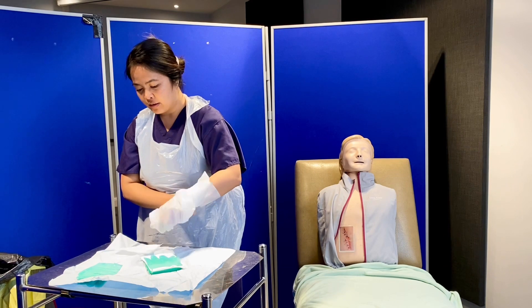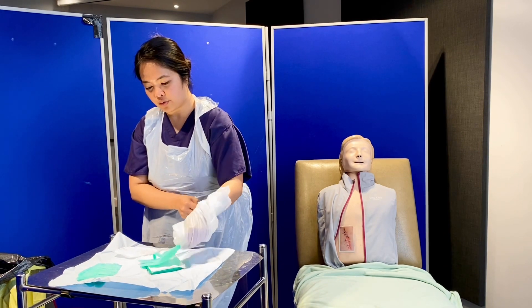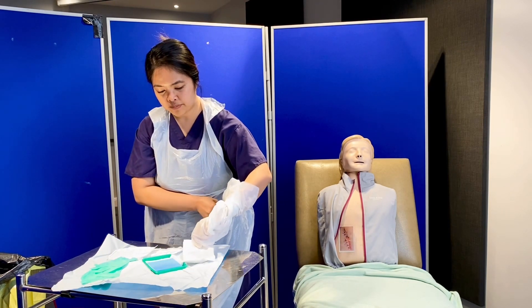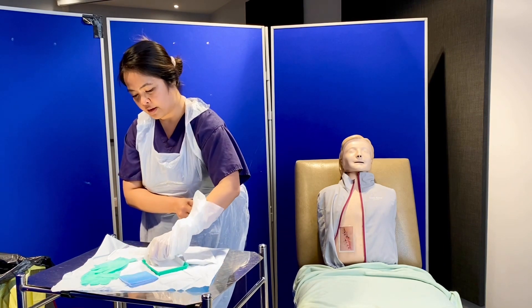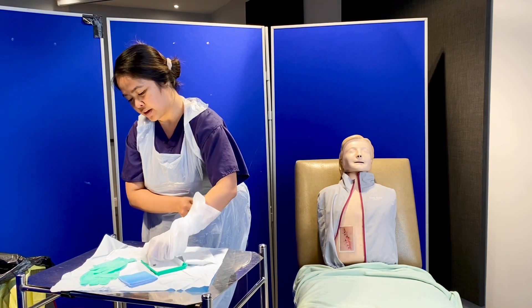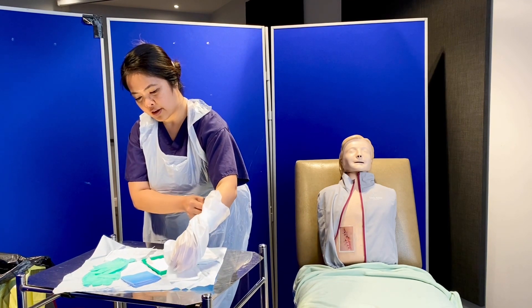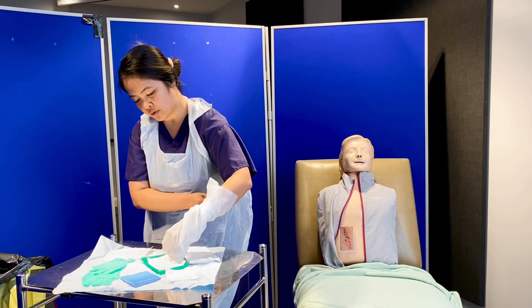I have here my measurement paper for the wound, another pair of gloves, another sterile drape, and some gauze. I'll be leaving some gauze in the basin so that when I clean the wound, it will be soaking there already.